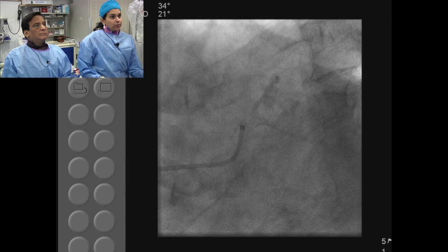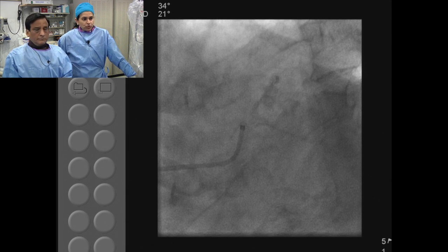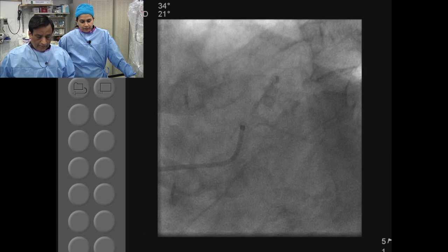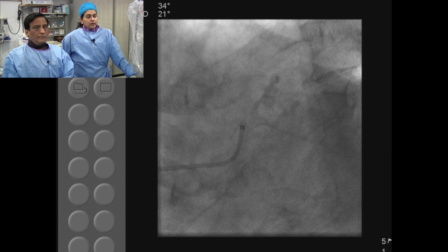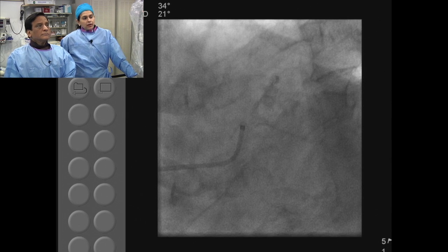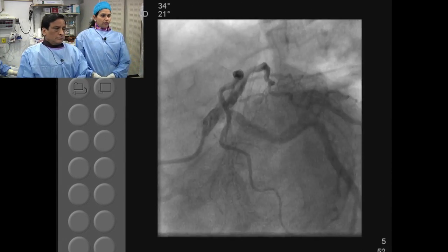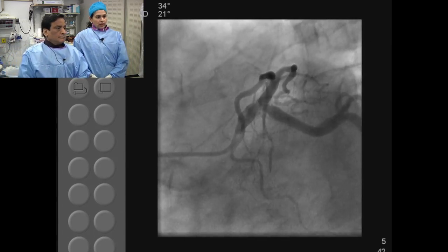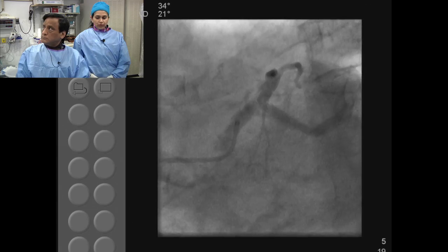The way the vessel looks, we will probably only be able to do the LAD — even that may be questionable. If the disease is more than 90 percent, once we have the OCT catheter across and give some dye, if you do not see any dye flowing through the vessel distally, it is not safe to do the OCT. Regarding burr size — it is heavily calcified, which is angiographically apparent. We are going to burr both LAD and circumflex, definitely starting with a 1.75 burr. Doing atherectomy of the circumflex with more than a 1.75 with that angle may be questionable.